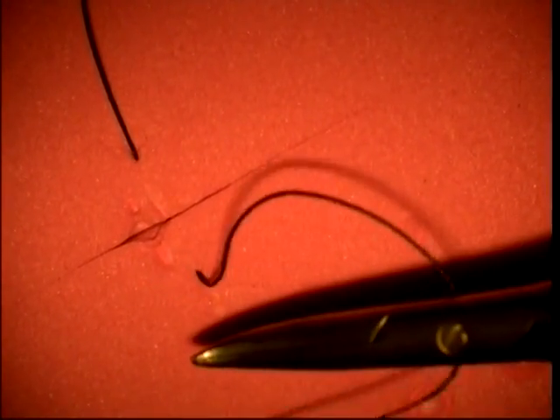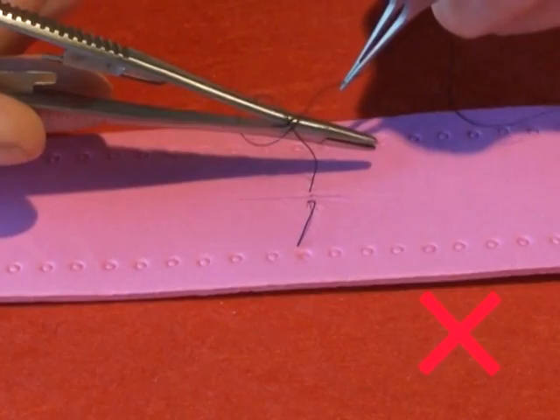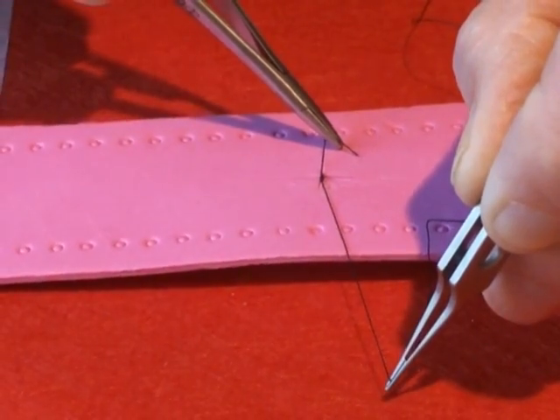Grasp the long thread with the forceps — a suture tying forceps — and wind the thread twice around the needle holder in a forward direction. Then grasp the short end of the thread in the jaws of the needle holder, and have the two ends of the thread crossing over. Don't wind the thread backwards, and make sure that the threads cross over, so that the thread which is away from you comes towards you, and the thread which was towards you comes away from you.